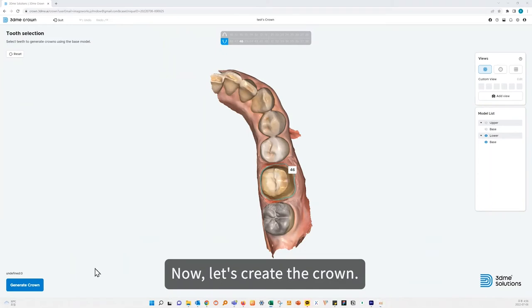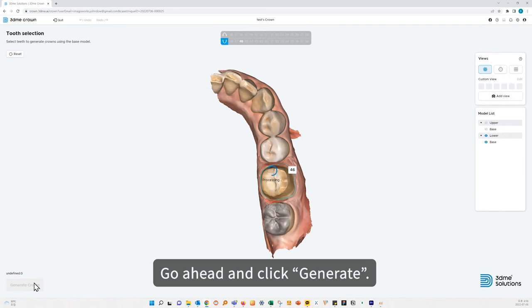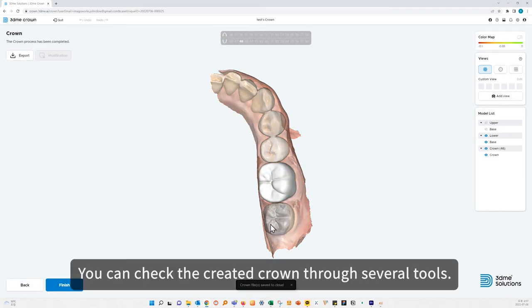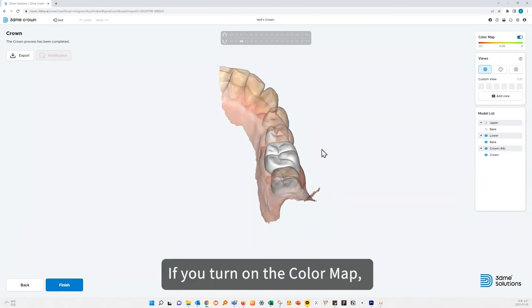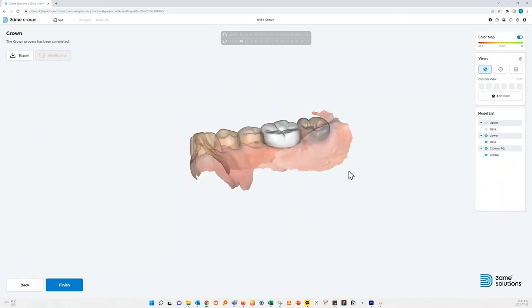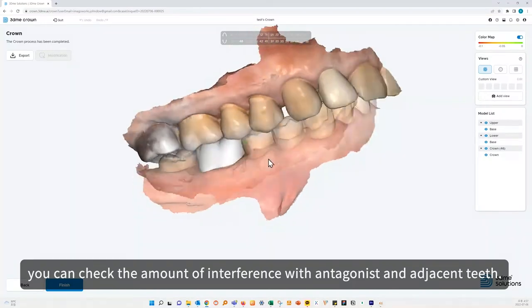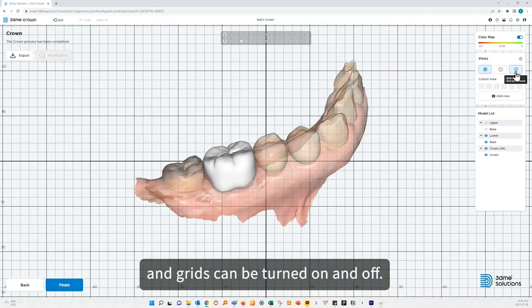Now let's create the crown. Go ahead and click Generate. You can check the created crown through several tools. If you turn on the color map, you can check the amount of interference with antagonist and adjacent teeth. Views show data in different modes such as textures and wireframes, and grids can be turned on and off.